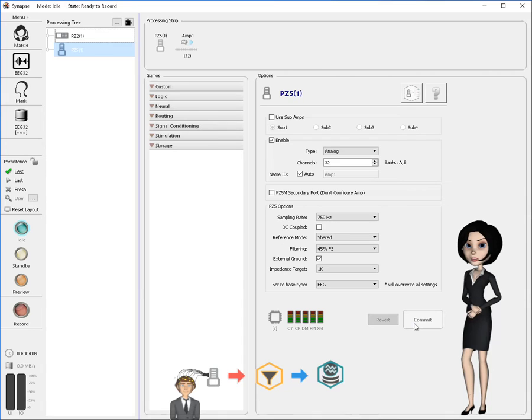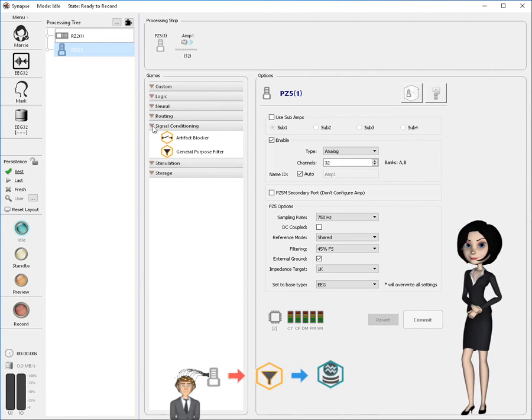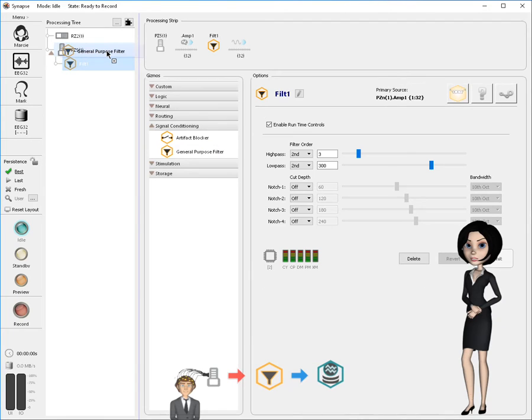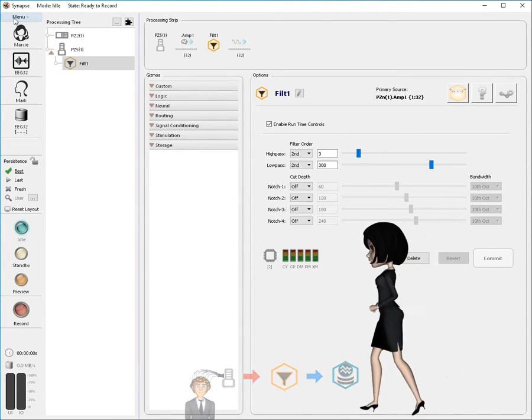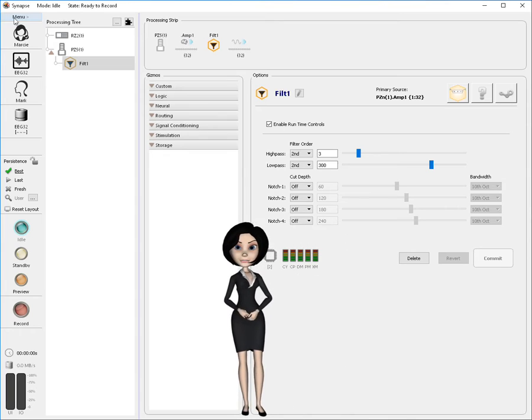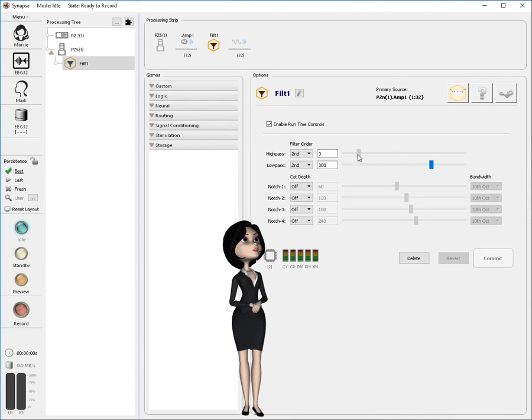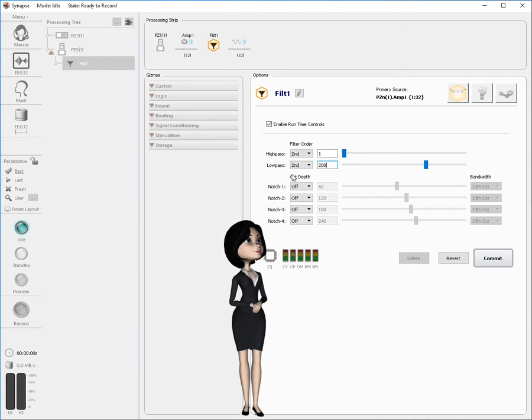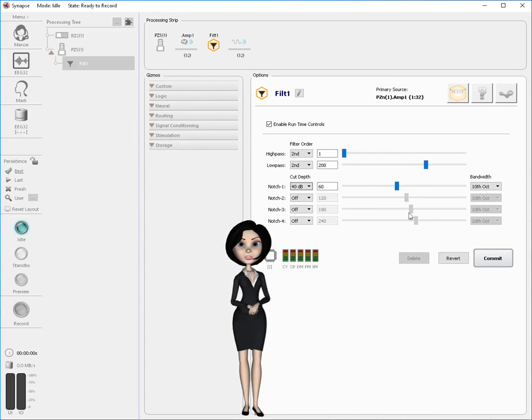The next component needed as we look at our data flow is a filter. Go to the gizmo selection panel and expand the signal conditioning category. When it is revealed, select the general purpose filter. Drag this gizmo and drop it on the PZ5 in the processing tree. The general purpose filter gizmo has six cascaded filter sections that can be configured by you. In this case we will be using the high pass at 1 Hz and the low pass at 200 Hz. Also, we will enable a notch filter to remove any 60 Hz interference from the power mains. To accept these changes in the dialog, press the commit button.